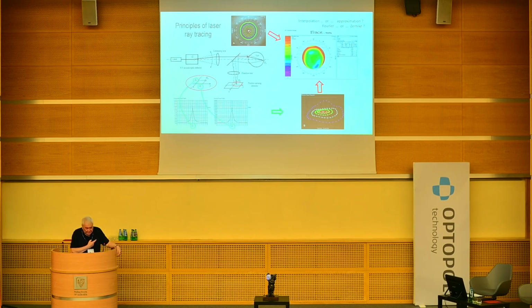So in the schematic, you see the laser and you see the acousto-optic deflector. In the center of scanning is put the front focus of the collimating lens. So as an output from the collimating lens, you have parallel beams. The laser is scanned in angle in the acousto-optic deflector, but at the exit of the collimating lens, you have parallel beams entering the eye.